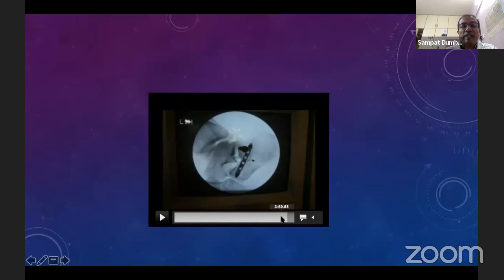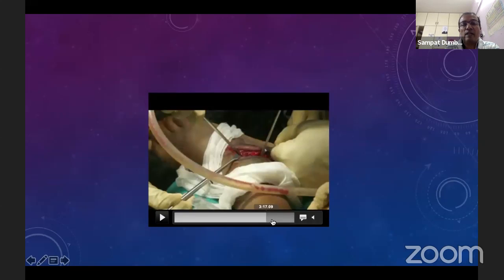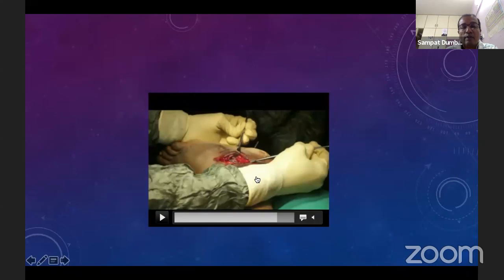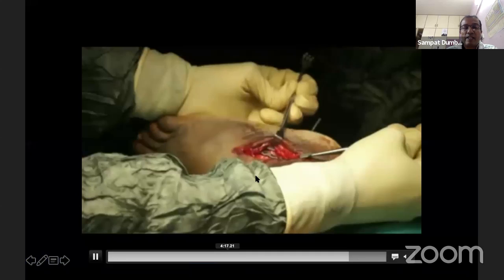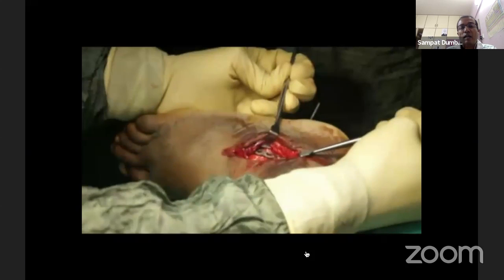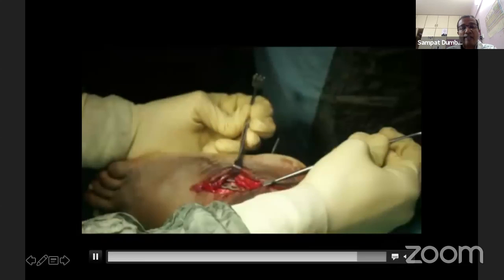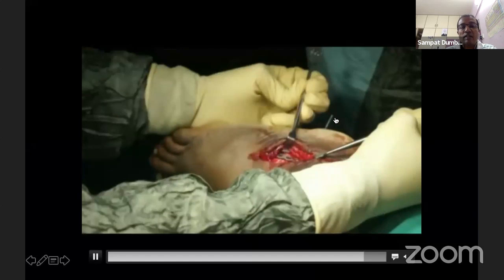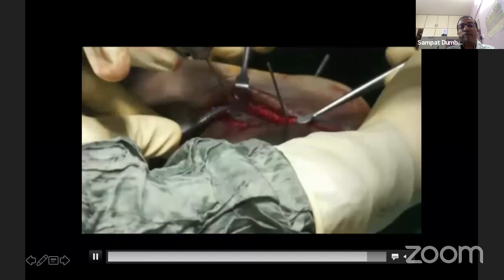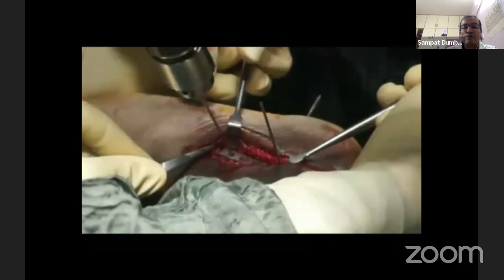Once you elevate it, you can even pass a screw or plate on the lateral wall. If it is needed, you can pass a K-wire or small plate. But this is one part of biomechanics. As Sharad said, this wire which acts as a joystick will correct first length, axial alignment, length, width. Particularly the axial alignment is very essential.